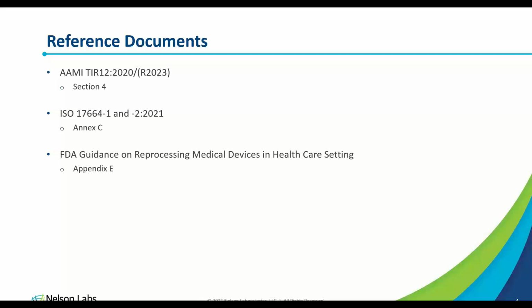And really, I would just do, you could create a table where you list the different design features, and then you can just mark an X by each one that your device has. And essentially the more X's by design features, the more difficult it's going to be to clean. And really what that means is, at that point, you need to start thinking about how involved or how in depth your reprocessing procedures need to be. As you have more of these design features that are difficult to clean, you're going to have a longer cleaning process and a more involved cleaning process.